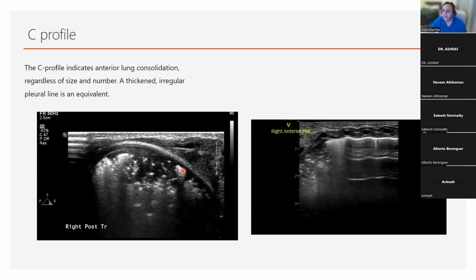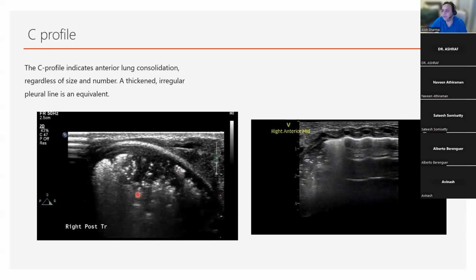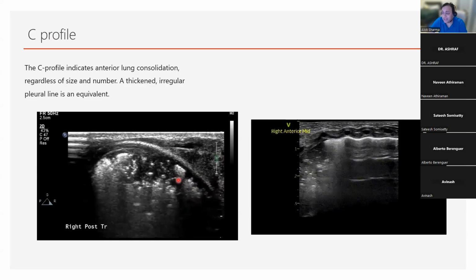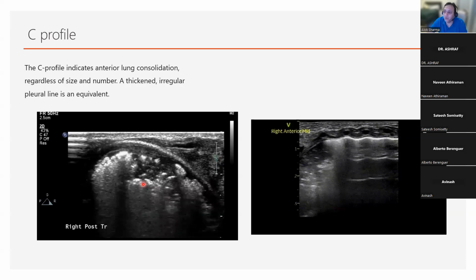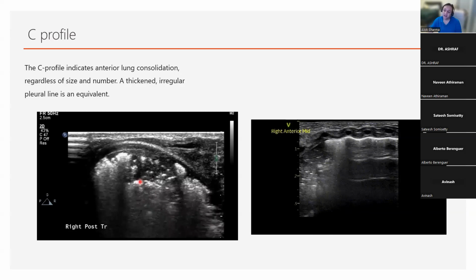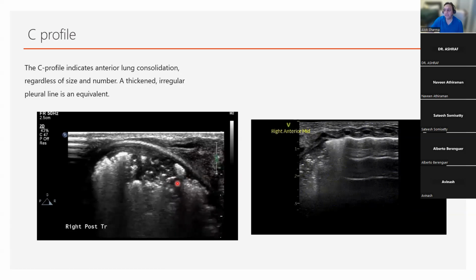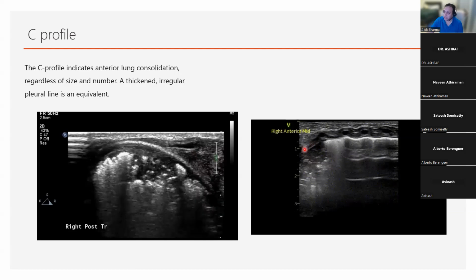Now, naturally, if this is a baby who has a CRP of 60, whose FiO2 is going up, then this could be pneumonic. And we'll talk about how you differentiate the two tomorrow. But more importantly, if this is a 23-weeker who's now 37 weeks of gestation, who has bulbar discoordination and has aspirated, then this could be a consolidation secondary to aspiration. So clinical correlation is very, very key. This is opposed to what we call atelectasis. And again, we'll talk about this in much more detail.